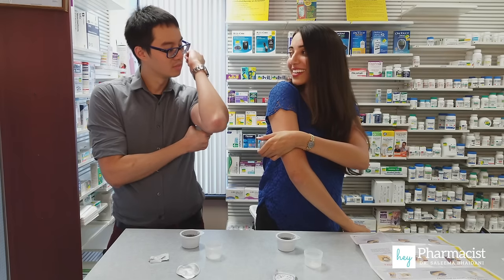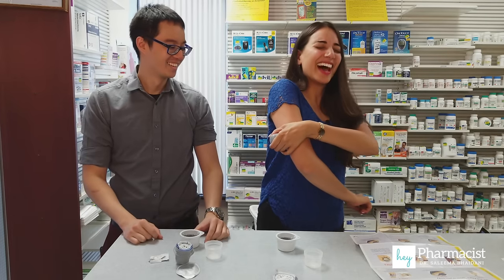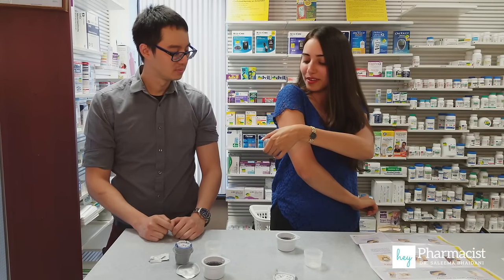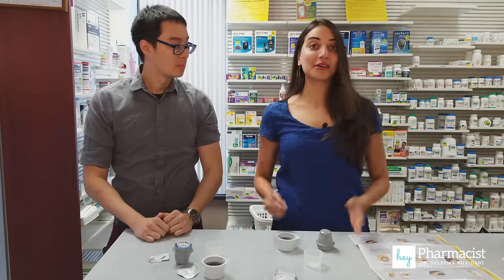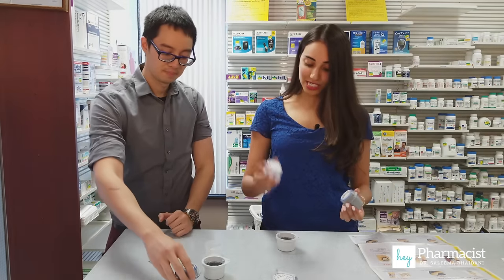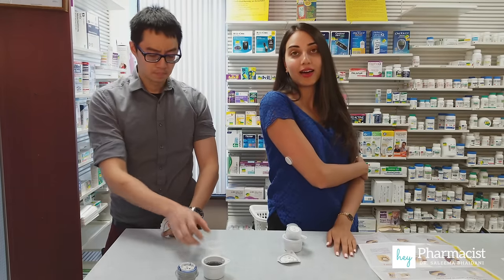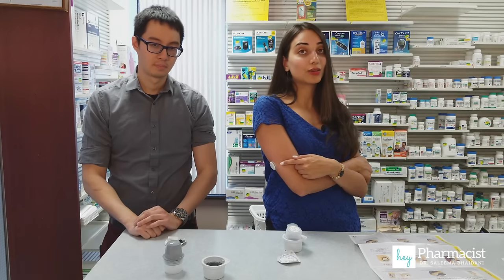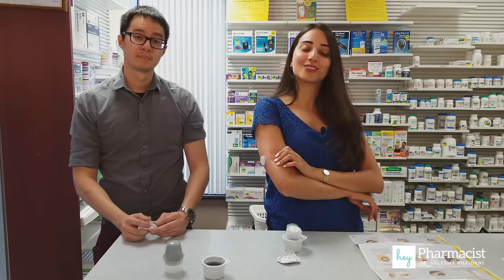So what your patient will see is a needle, but that needle is not going to stay in the arm forever. It's actually going to be a microfilament sensor that gets placed into the arm — the needle just helps with the placement. Did it hurt? No — just a little bit of a prick but not too much. And that's it, we're done. We can dispose of these and this will be good for another two weeks. It does have to stay on for one hour before you can use the reader to get your first reading, as it needs to calibrate to each of our bodies.